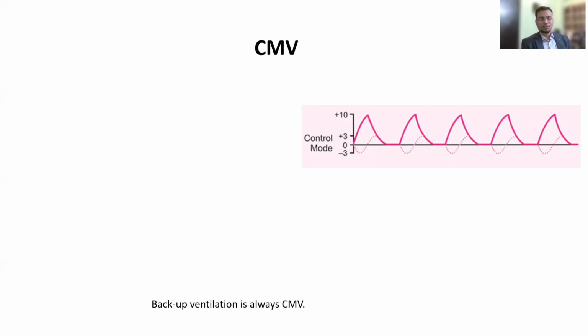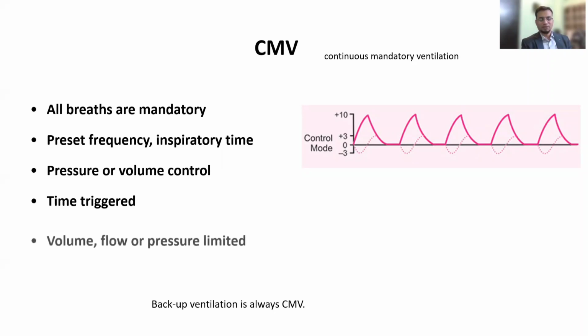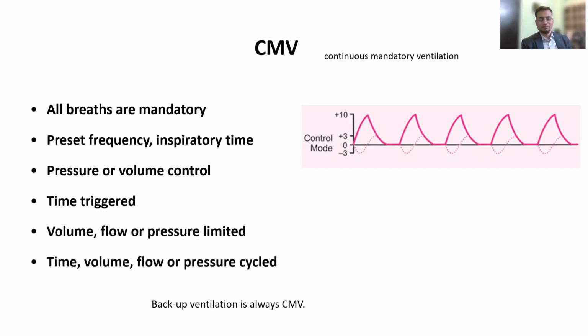All breaths are mandatory, with preset frequencies, time triggered, volume or flow or pressure limited, and time cycled. So this is about the CMV mode.